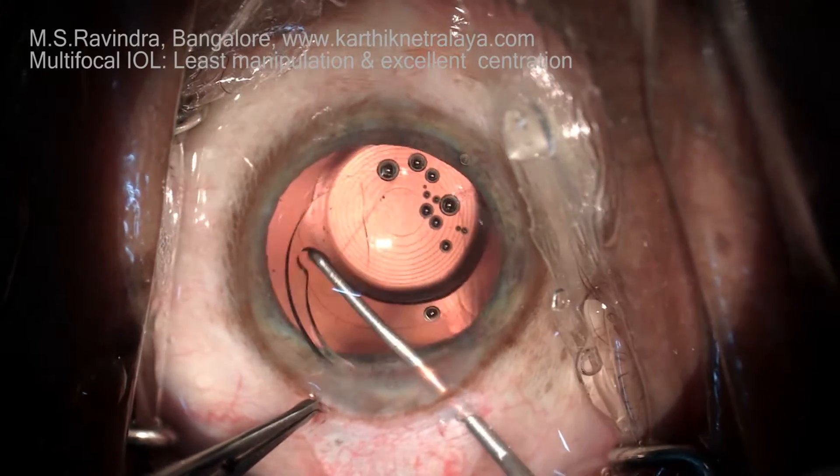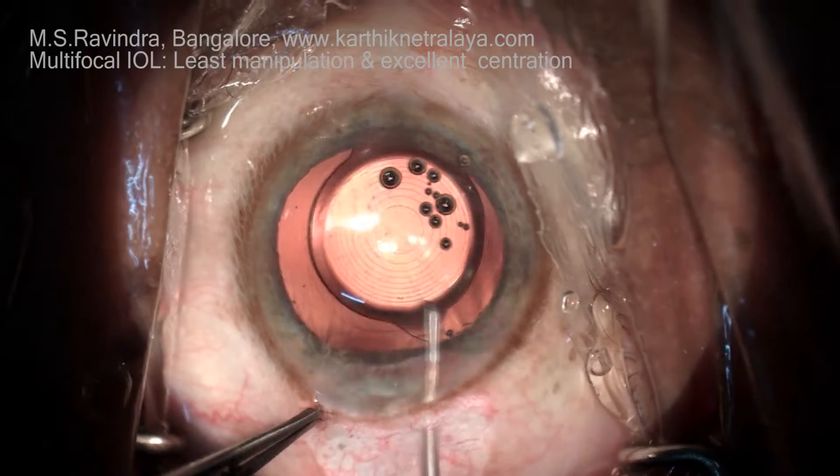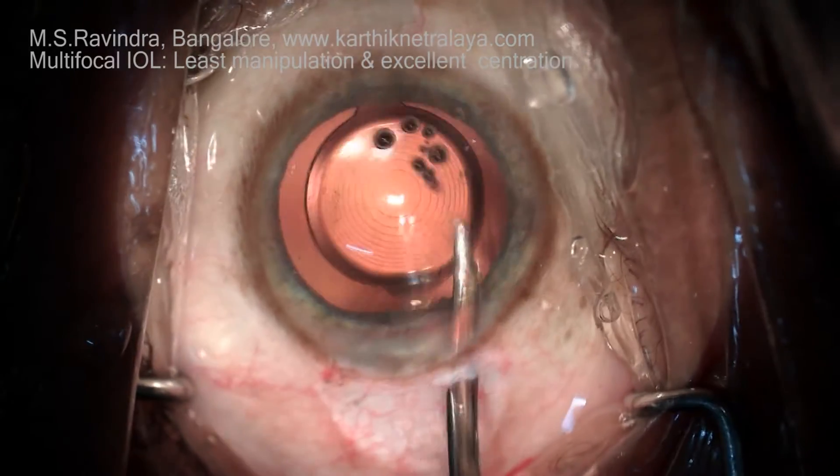It's a very nicely made lens, and this technique of insertion without folding and without distorting the intraocular lens is probably the ideal way to maintain the architecture of the intraocular lens.